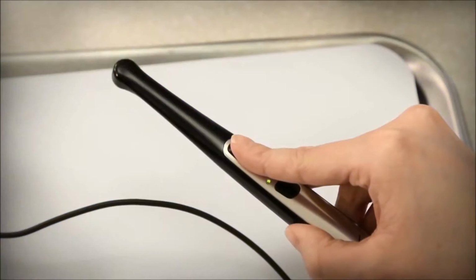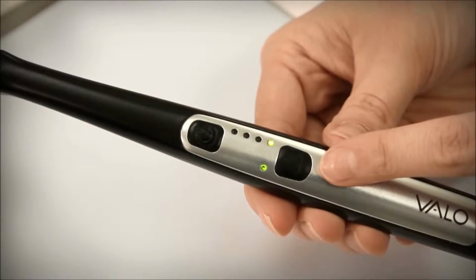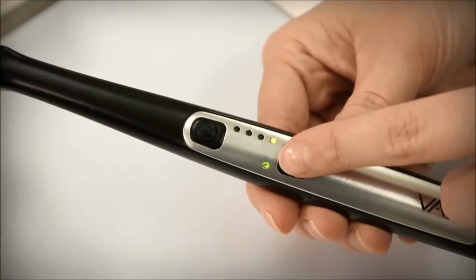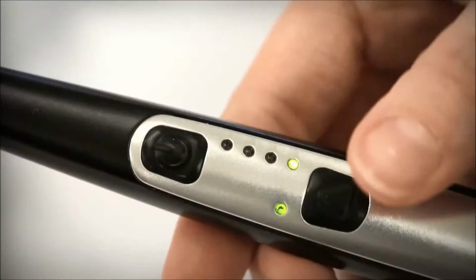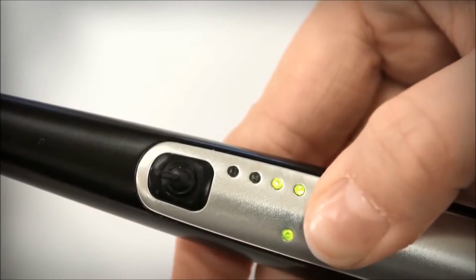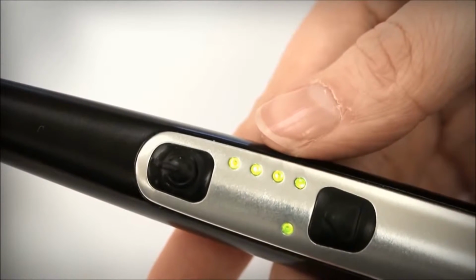The top button is the power button. Press to activate VALO. The bottom button is the time and mode button. This button is used to change the timing interval or the mode. Standard mode is shown by a solid green light on the left of the panel. The 4 lights on the right represent the time. To change the time in 5-second intervals, press the time and mode button. The beep and illuminated lights will change with each press of the button, cycling from 5 up to 20 seconds.